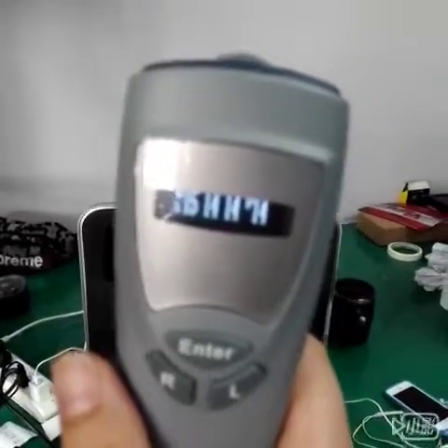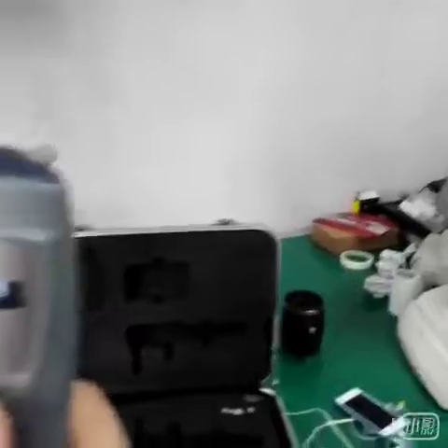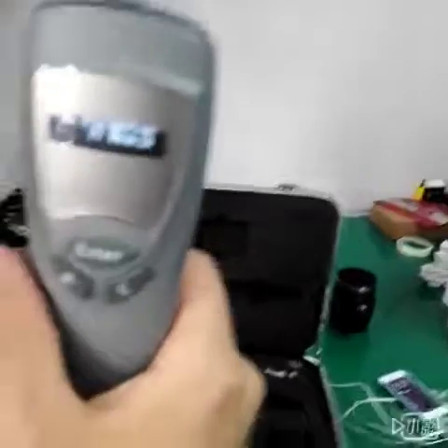Now we're preparing for printing out the data. Firstly we need to press the enter. Now you can see this surface and then we connect with the wireless printer.